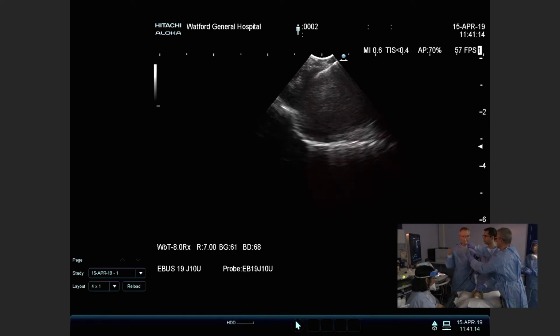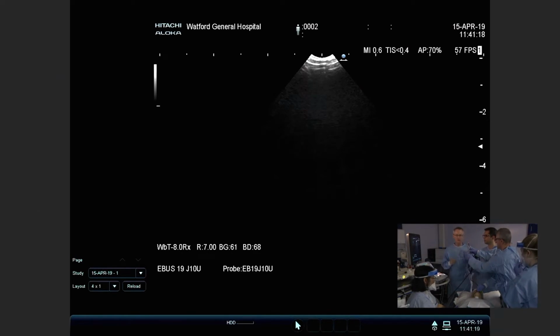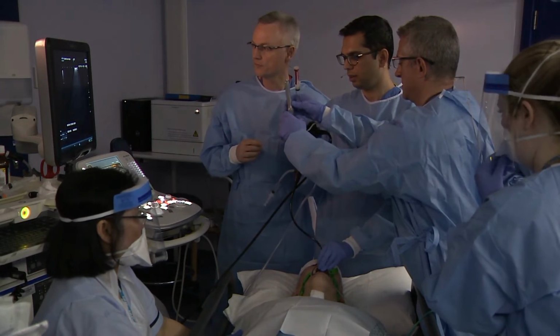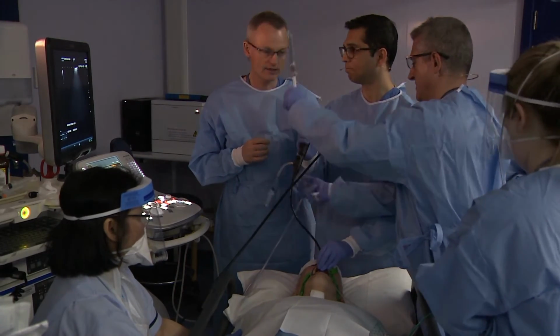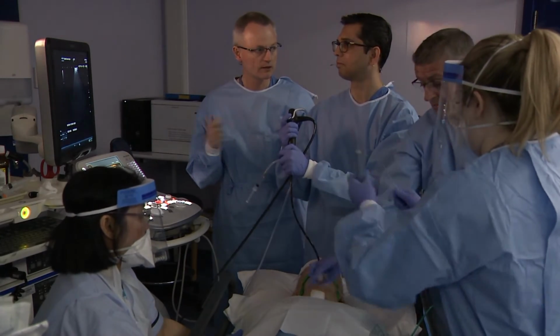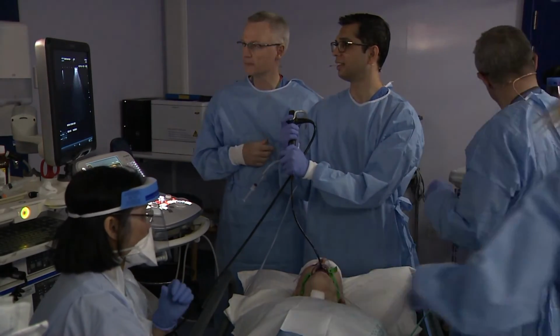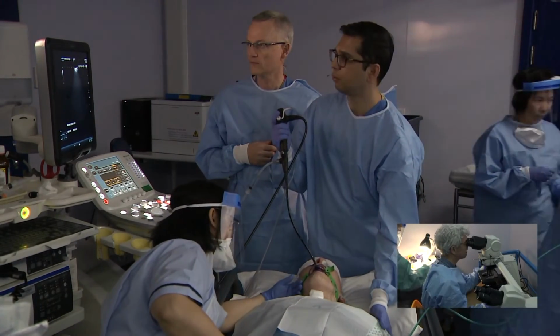Do you notice that every node is different? Some can be soft, some can be quite hard. The hardest ones are the fibrosed sarcoid. Right. And probably the tissue yield could be affected as well. Indeed, it can be tricky. All right. Sorry, we've taken the needle out.